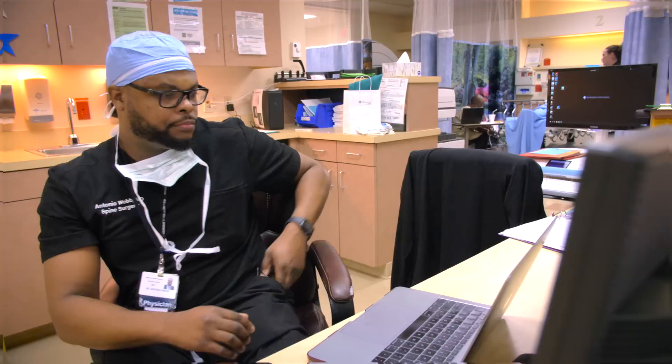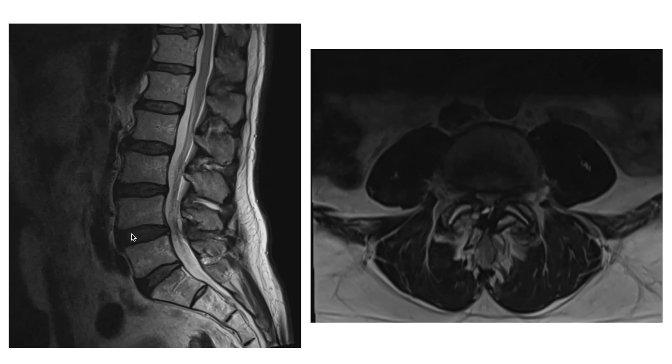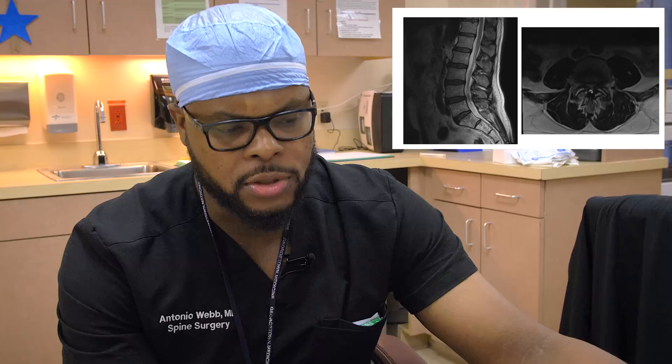These are the patient's MRI images. This view here is called the sagittal view. You can see that this patient has multi-level disc degeneration disease. These discs here are dark — they're supposed to be a whitish color. This is the spinal cord part where it ends and turns into the cauda equina or thecal sac. You can see there's quite a bit of pressure or stenosis, meaning this patient has pressure on his spinal canal and nerves. He also has a large cyst — we call it a facet cyst — and this cyst is contributing to some of his leg pain.